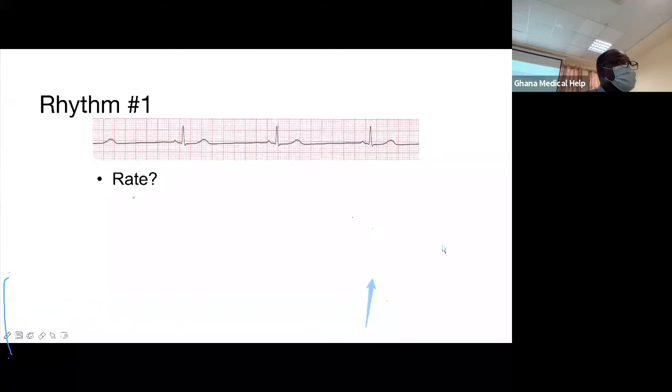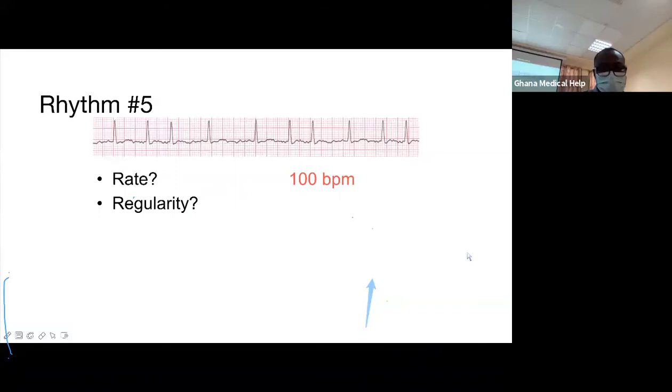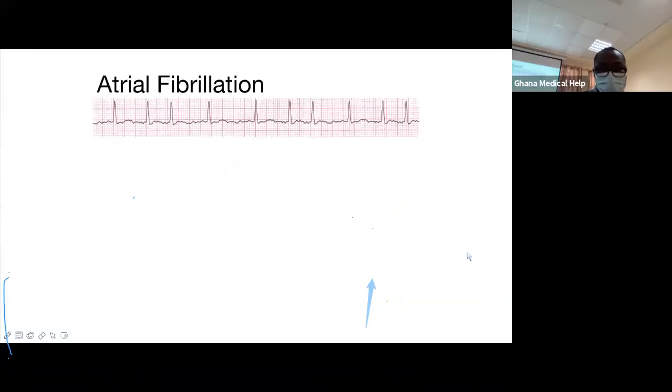Well, atrial fibrillation. Okay. So someone is asking about atrial fibrillation. Please, the atrial fibrillation, I got confused. Dr. Amina, if you can unmute yourself and let me know the specific part so that we can take it. Hello, please, how to know it is atrial fibrillation? That's how I got confused. Okay, fantastic. Great. So on to atrial fibrillation.